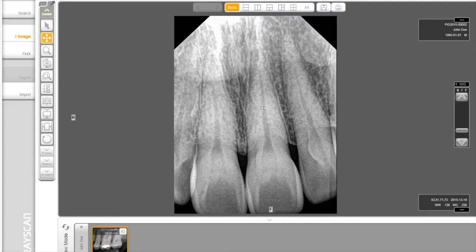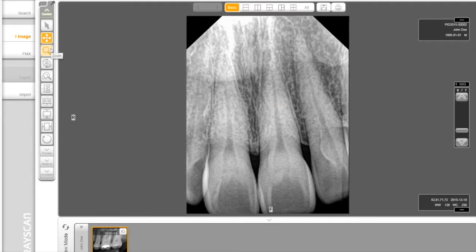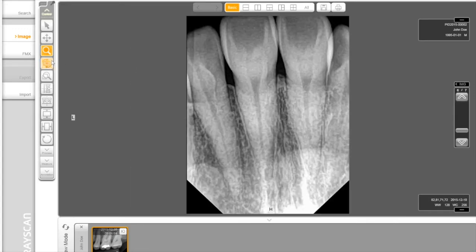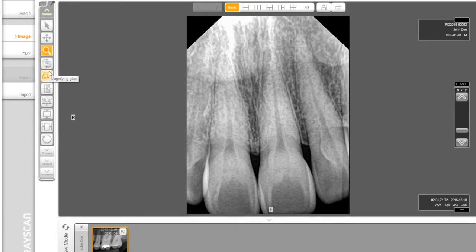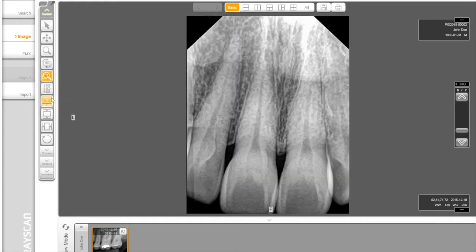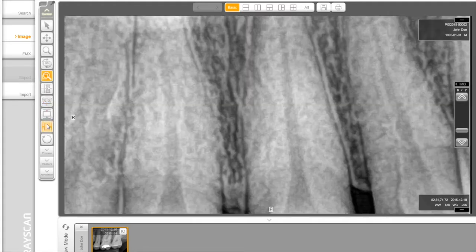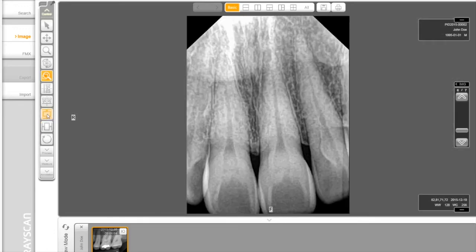If you single left-click on Move, this allows you to move the image. You can also go to Zoom. This tool allows the user to click and drag on the image to zoom in and out. Below is the Rotate tool. The spot magnifier button will zoom into a user-specified area of the image by clicking and holding the left mouse button. To flip the images, use the vertical and horizontal flip buttons. The Fit to Screen button will make the image fit within the exact size of the window, vertically and horizontally as well.